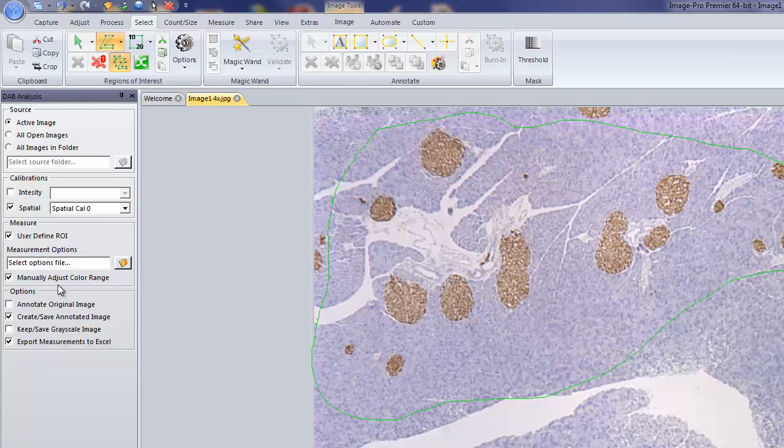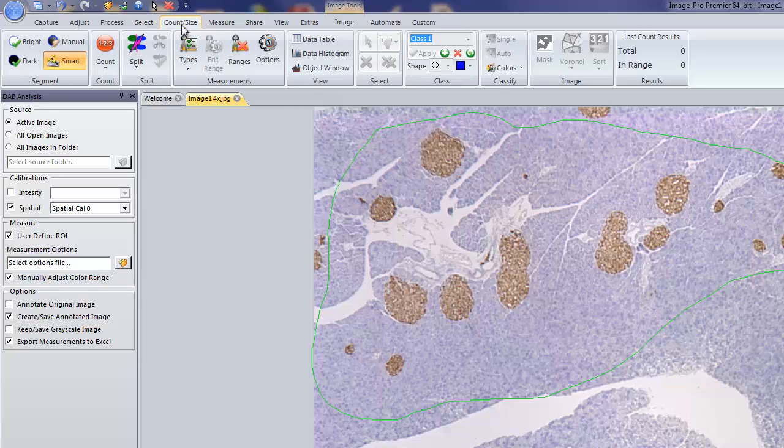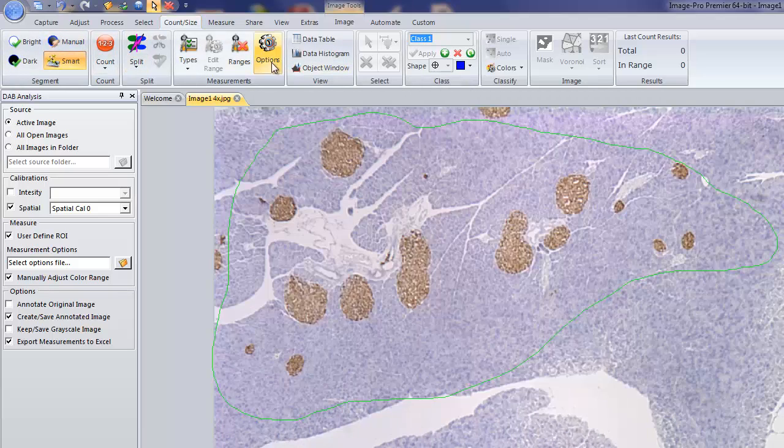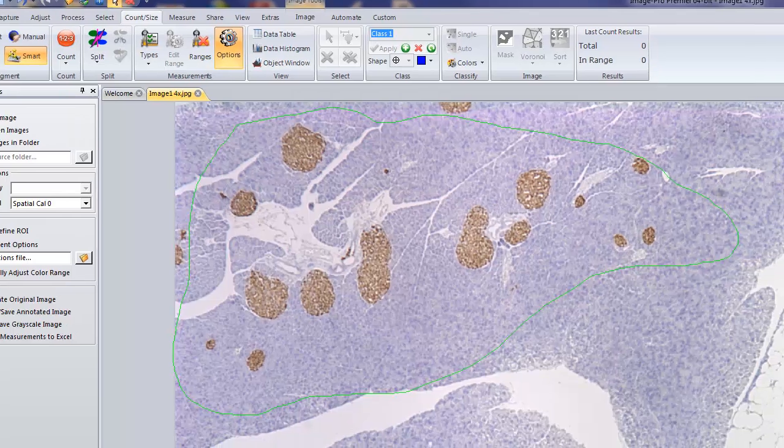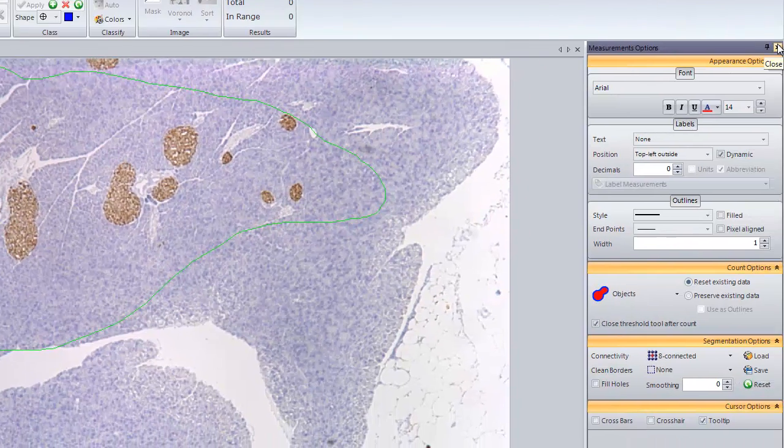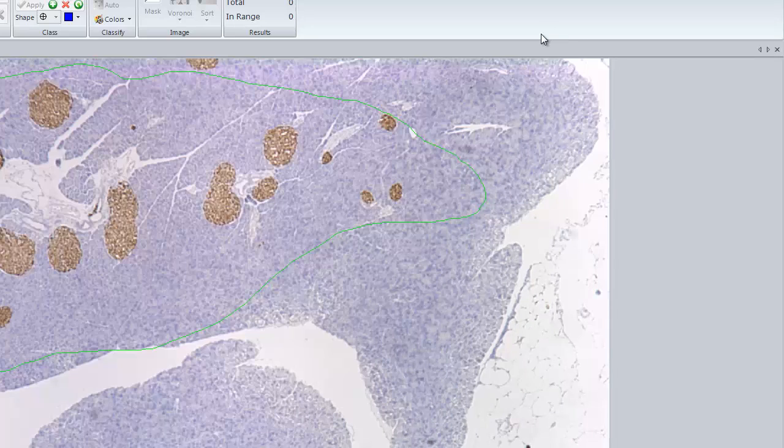Again, for other applications, we can also create a new settings file and save that by going into the Count Size ribbon, setting up and actually saving the options once we have that workflow set up here. If you'd like to learn more about Count Size, there is also a short movie available on the Media Cybernetics website.